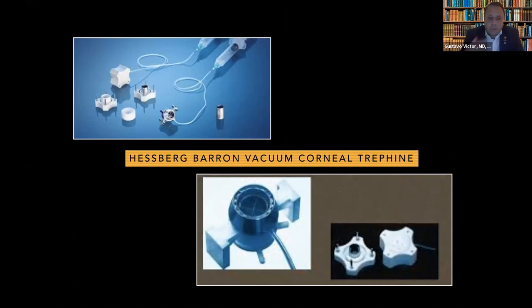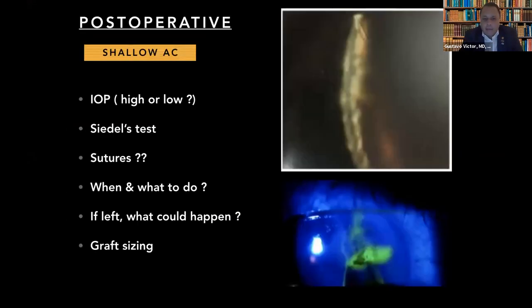If I understand, you talk about this, the anterior chamber is shallow. You should see all the sutures, and then you should see if there is aqueous going out. So you should very carefully see everything like this and make some bubble. You can have a fake suture because it's very early post-operative, and then you should go this way.